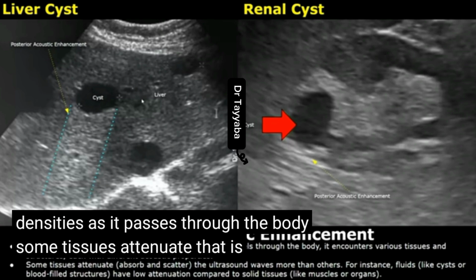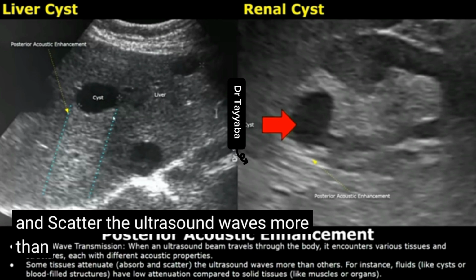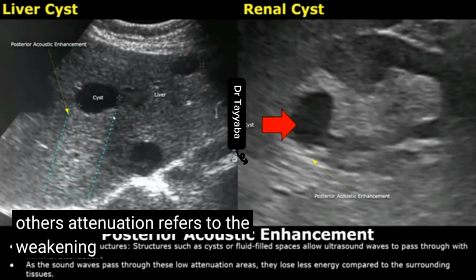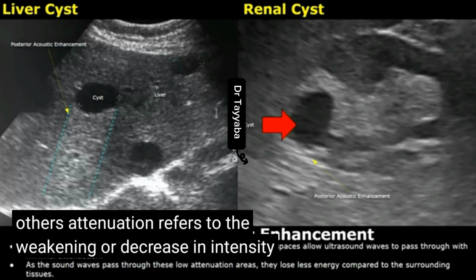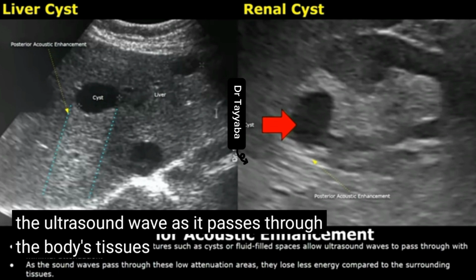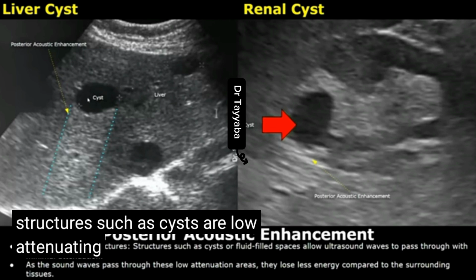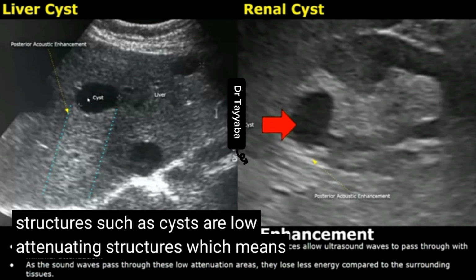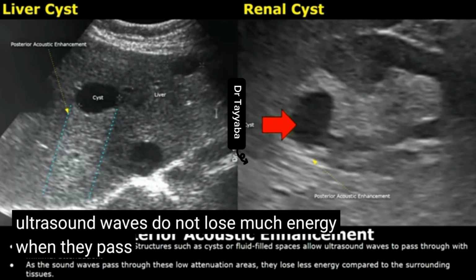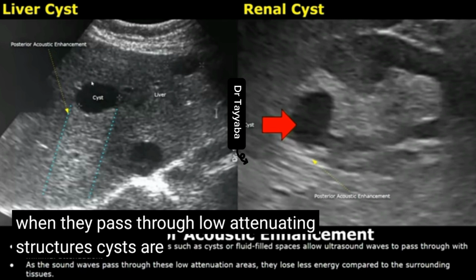Some tissues attenuate, that is, absorb and scatter the ultrasound waves more than others. Attenuation refers to the weakening or decrease in intensity of the ultrasound wave as it passes through the body's tissue. Fluid-filled structures such as cysts are low attenuating structures, which means ultrasound waves do not lose much energy when they pass through low attenuating structures.